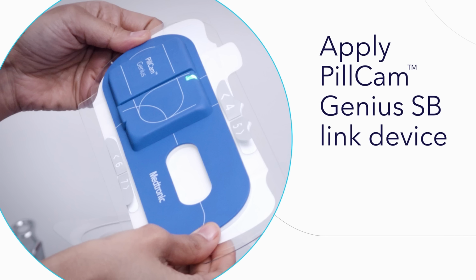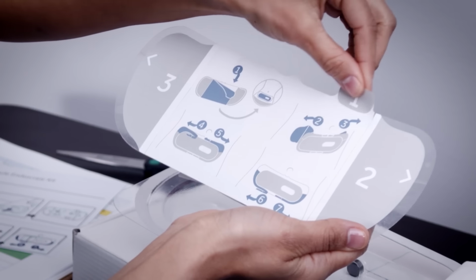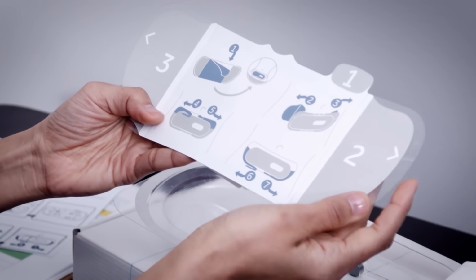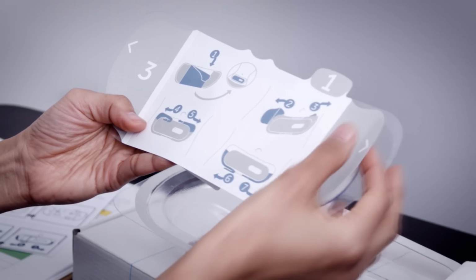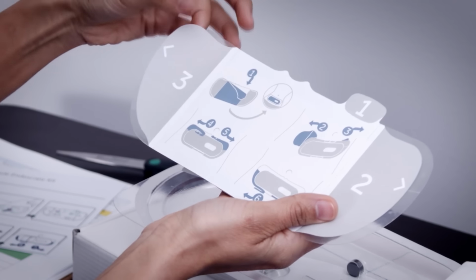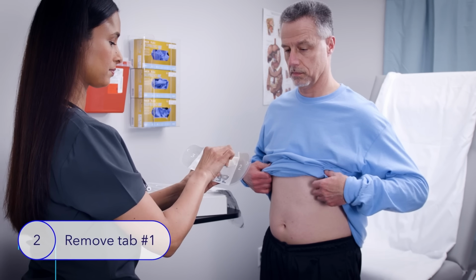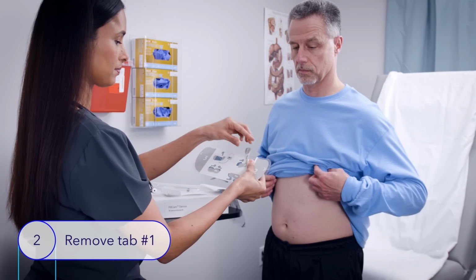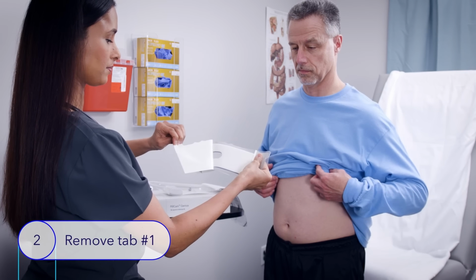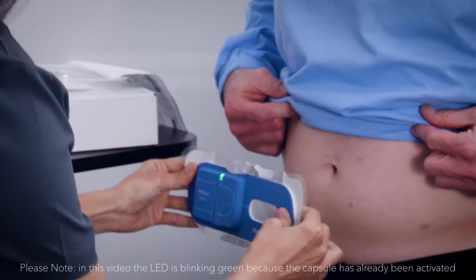To apply the link device, first ask the patient to stand and expose their lower abdomen, a few inches above and below the belly button. As you apply the PillCam Genius link device, you will need to remove a series of tabs from the link device to expose adhesive that sticks to the patient's skin. First, remove the largest tab, marked with a number 1, from the rear center of the link device. After removing, turn the device so that the adhesive faces the patient.